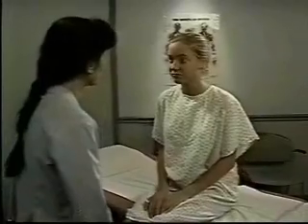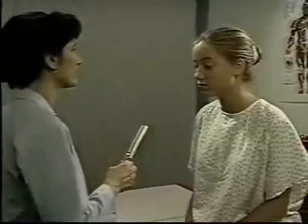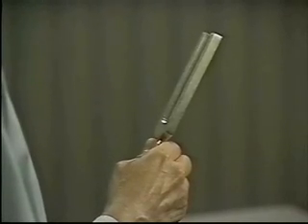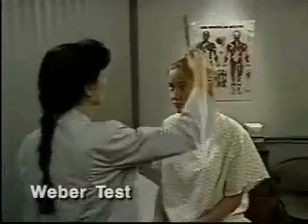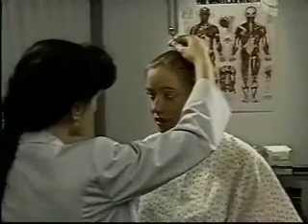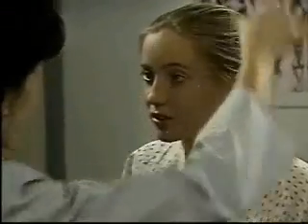If hearing is diminished, do the Weber test, which checks for lateralization of bone conduction, and the Rinne test, which compares air and bone conduction. For each test, use a relatively high-pitched tuning fork, such as one of 512 Hz. To do the Weber test, place a lightly vibrating tuning fork firmly on top of the patient's head. Ask where the patient hears the sound, normally in both ears or the midline.